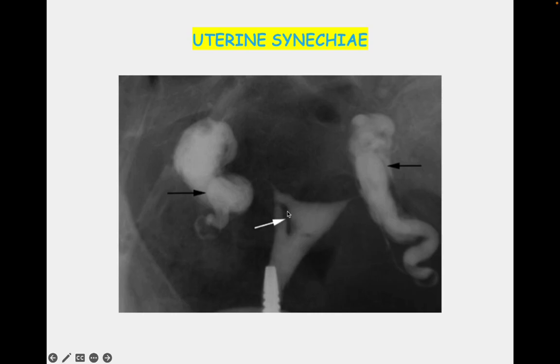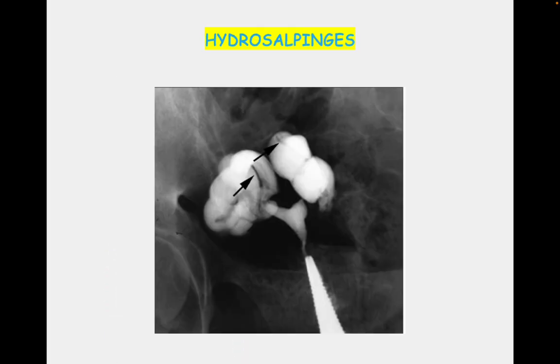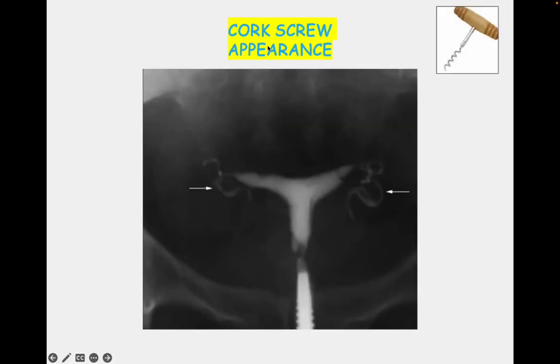Another picture shows uterine synechiae. This picture shows hydrosalpinges — you can see the dilated, crowded, coiled tubes, which is suggestive of hydrosalpinges. This radiograph shows the corkscrew appearance of the tubes, which is characteristically seen in patients with tuberculosis.